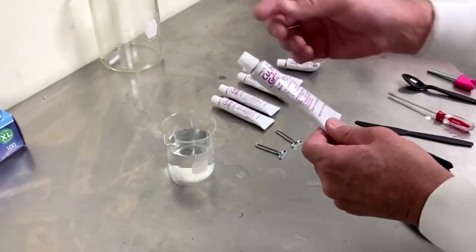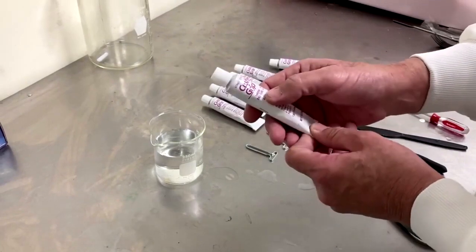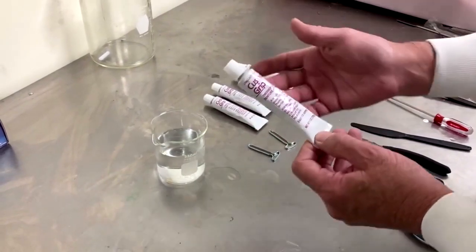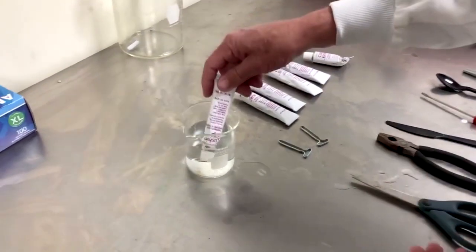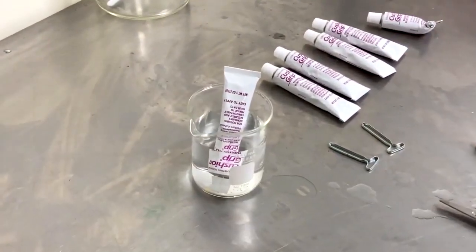Today we're going to be sharing some tips and tricks on how to get cushion grip out of the tube. Cushion grip is a thermoplastic denture adhesive, meaning that when you warm up the tube, the heat allows for the adhesive properties of the cushion grip to work.